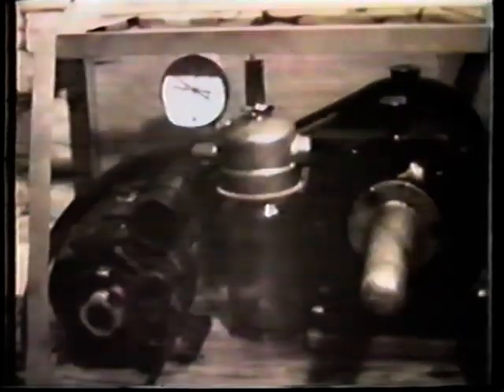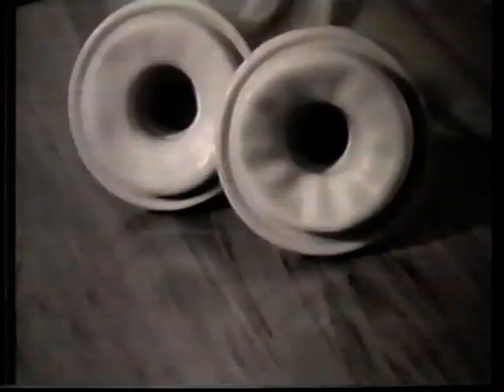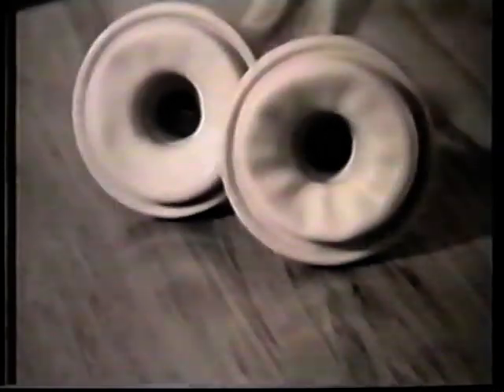From nearby Rurakura Animal Research Station came the answer to the failing milk supply, a vacuum-type breast pump working from an ordinary power point on the same principle as the milking plant. Featherweight cups lined with a very soft foam rubber and a gentle pulsating action. The cooperative effort of Rurakura Animal Research Station and National Women's Hospital of Auckland. The children promptly nicknamed it the Mummy Milker.